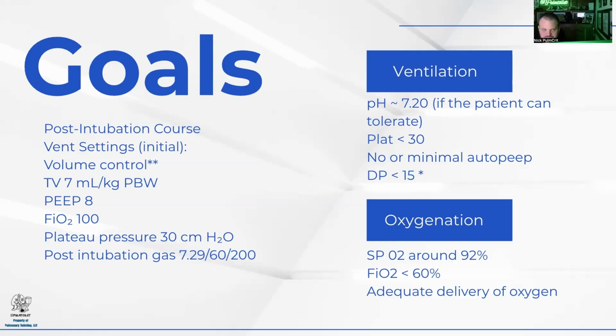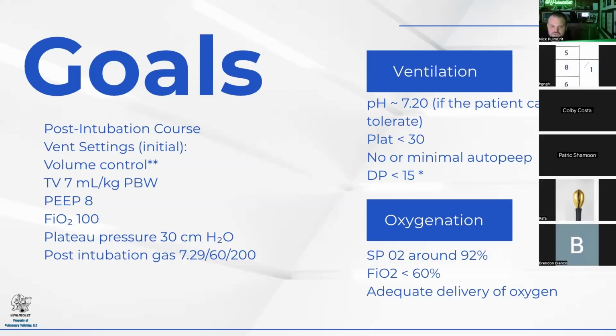The vent will ding more. We don't like the vent dinging because that means we have to think about why the vent is dinging. But ultimately, if the vent is dinging, we should go in there and figure out why the machine keeping the patient alive is dinging, right? So that's my approach. That's what I think. Everyone's a little bit different.